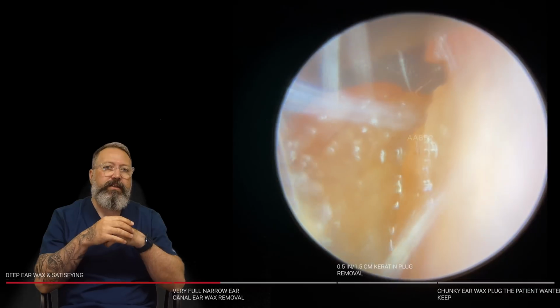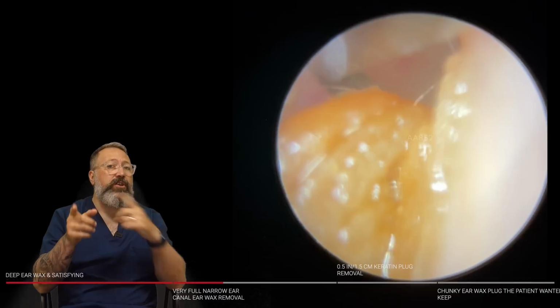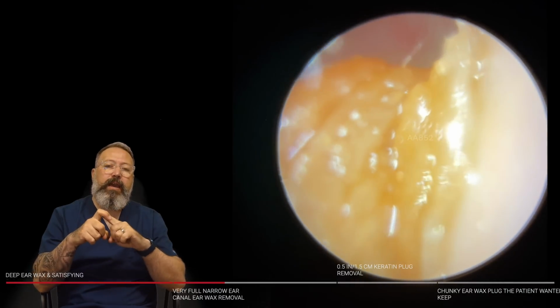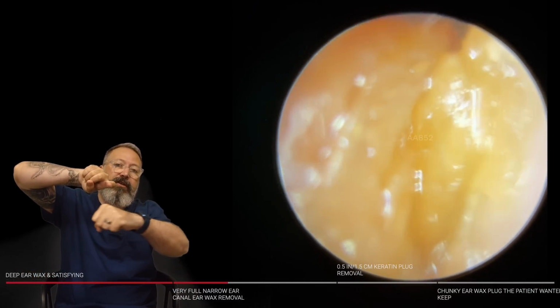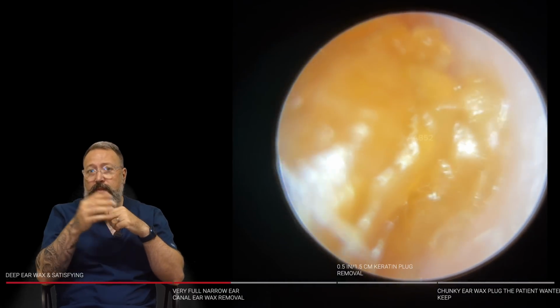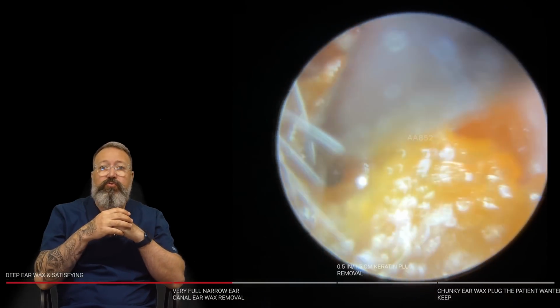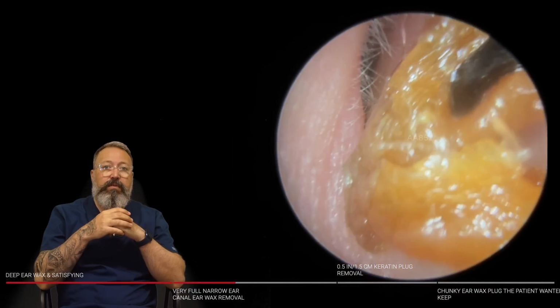Let's drop behind. If this is the first ever time you've seen a video, if we use a manual tool like this, it is known as curettage. If you see this particular one, St. Bart's hook is a 90-degree angle hook. So you go in, imagine that's the block of wax, you go in sideways, turn the hook, and you can pull, which is exactly what we're doing here. So we draw the wax down the canal, out that comes, there you go.